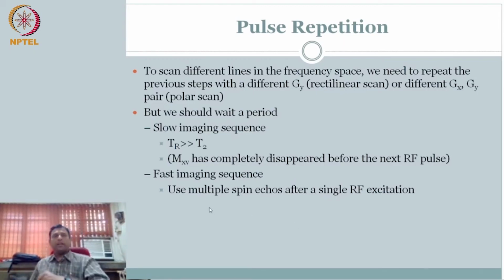That means I don't want it to naturally dephase, which takes so much time, right? Dephase and then comes spin lattice interaction, your T1, it comes to equilibrium. If I want to repeat the experiment multiple times, that is select the same slice, apply different GX, GY, same Z gradient, apply. I want to do this repeat several times. I want to have a better way of losing the signal from one acquisition before I start the next acquisition. So what can we do?